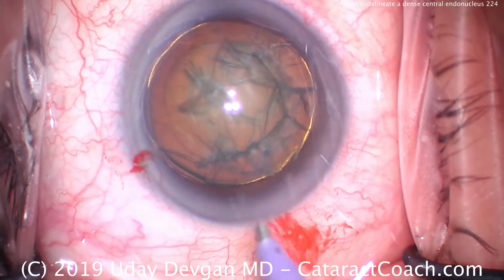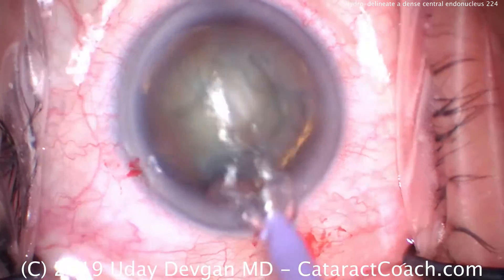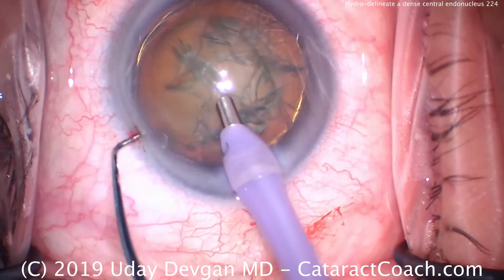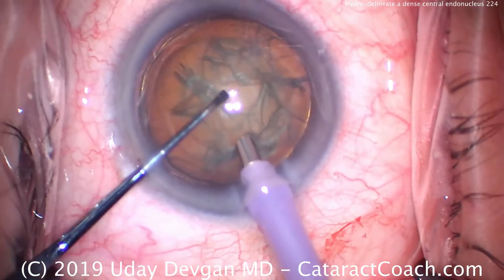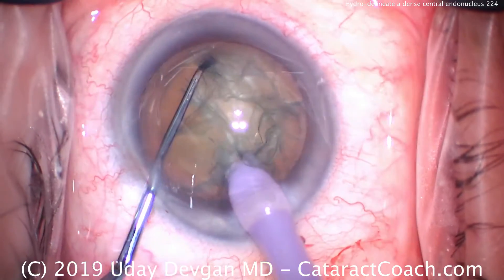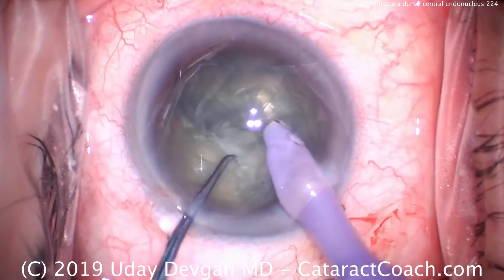We'll put our phaco probe in the eye along with the chopper. High vacuum, high flow mode. Going to buzz into that central endonucleus. Place the chopper as well, buzz in there.